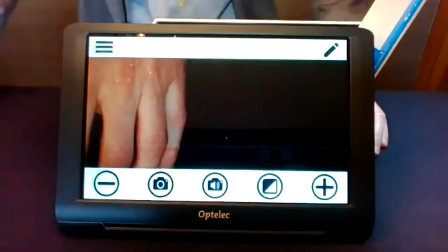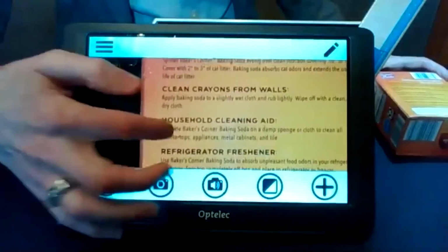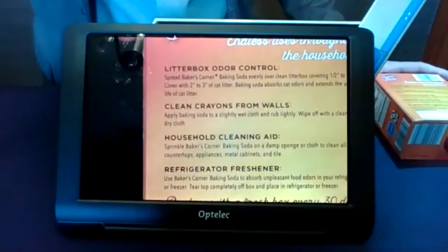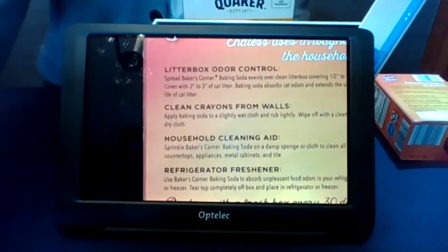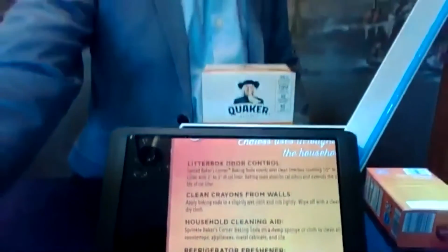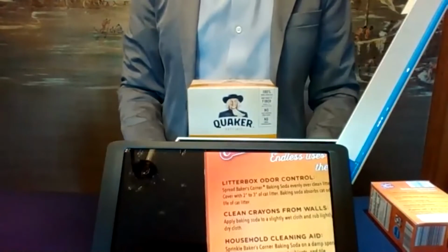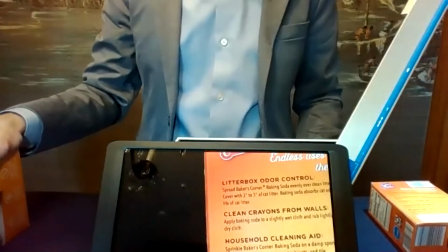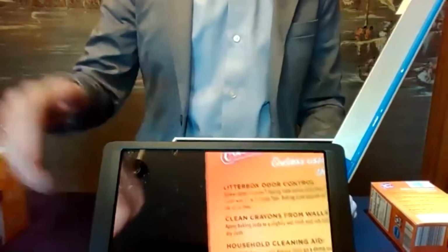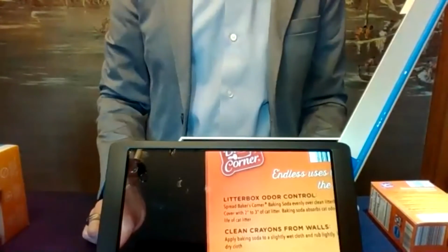And again, this is another great use case for why that extended camera comes in handy, because if this were a standard handheld portable video magnifier, you'd have to somehow try and balance and find the right field of view, depth rather, to make sure that the focus is on a rounded text bottle, with very small text that can be very difficult to place correctly to ensure you get access to the text.